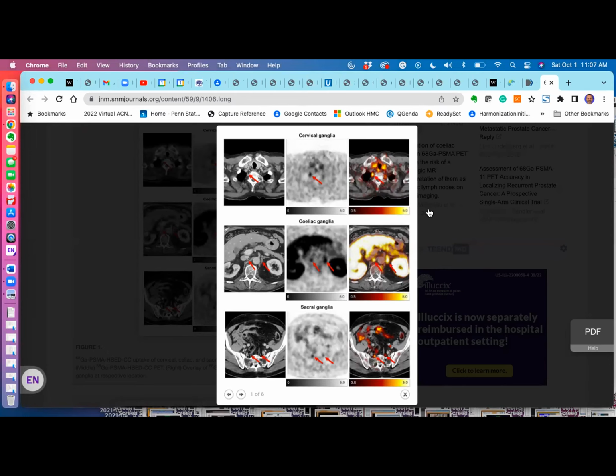This is just from an article that I randomly pulled up while you were presenting. It's an earlier 2018 article that points out several ganglia that commonly provide some of the false positives. Going back to your presentation, the first PYL case that you presented had the presacral lesion. How did you know it was not presacral ganglia? Because that's exactly what it looked like to me from afar over this presentation.